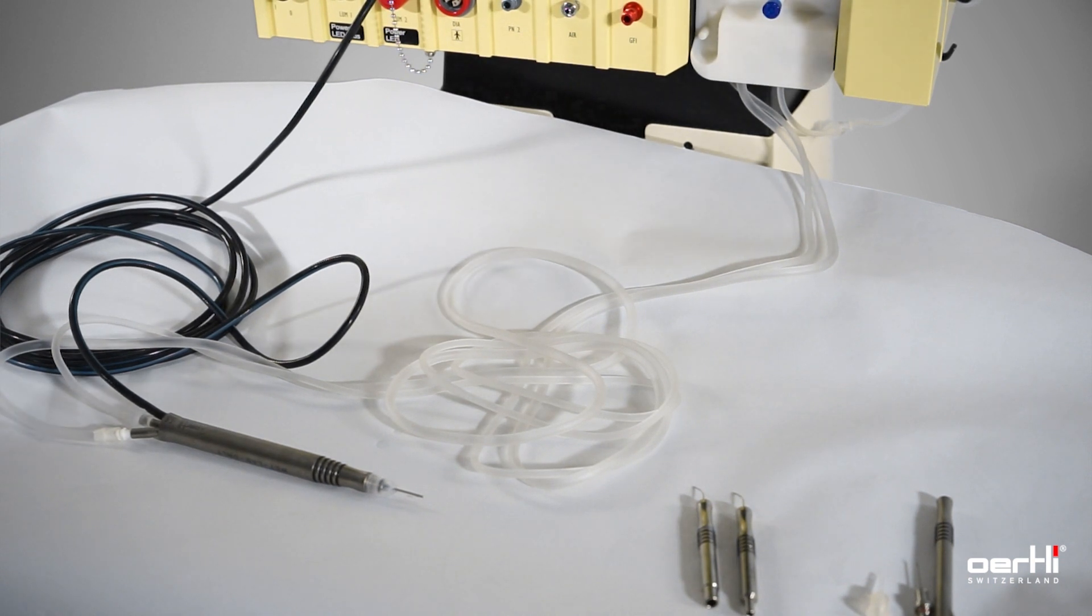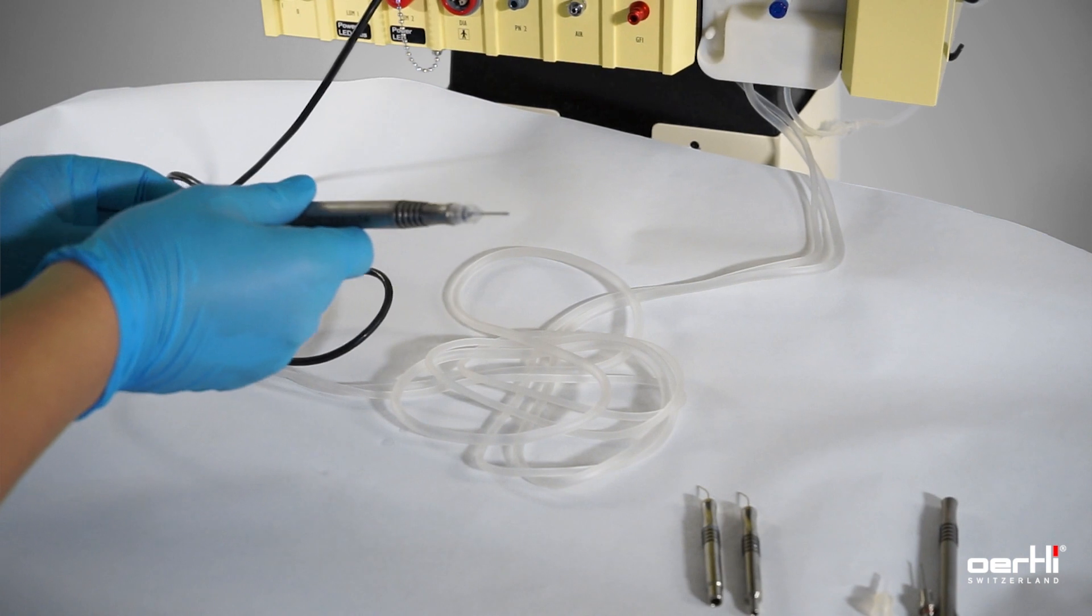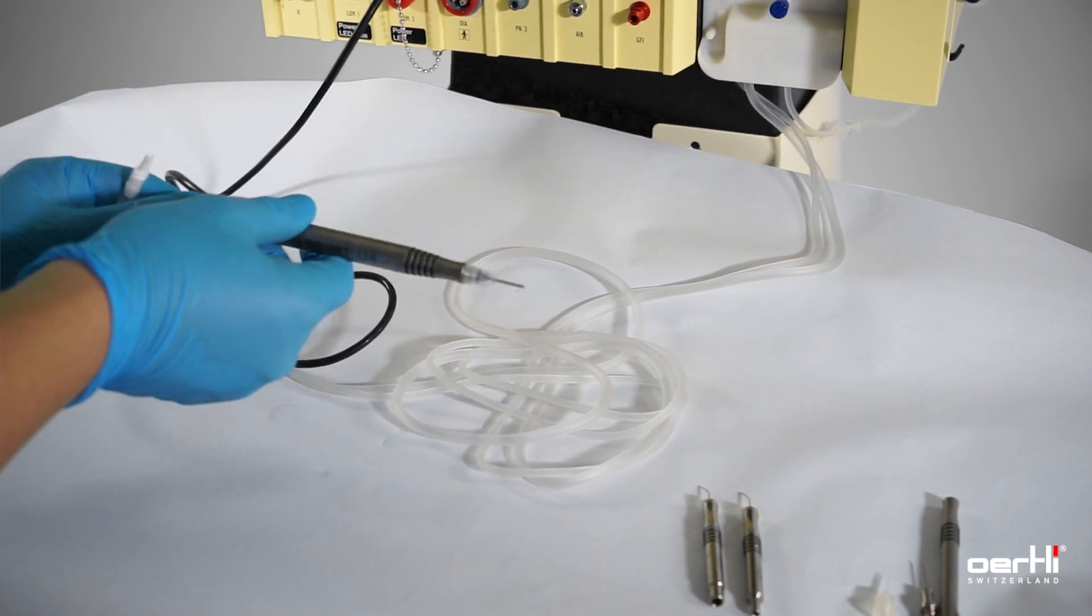After the lens removal, disassemble the irrigation line and aspiration line from the FACO handpiece.